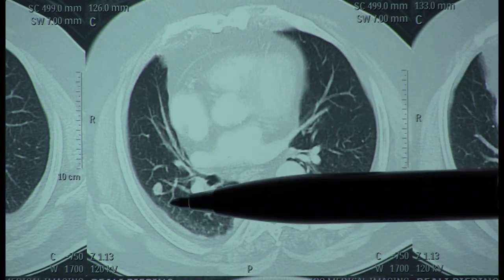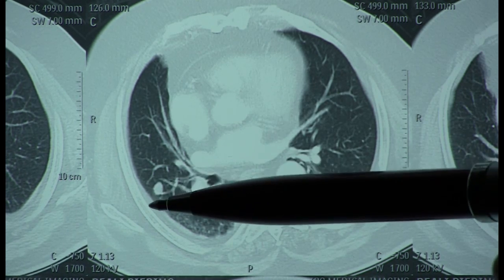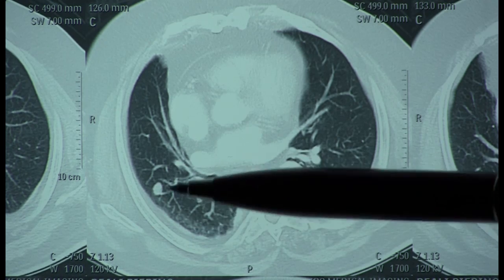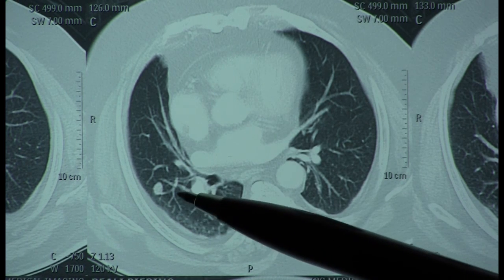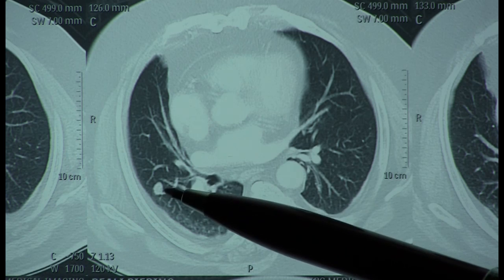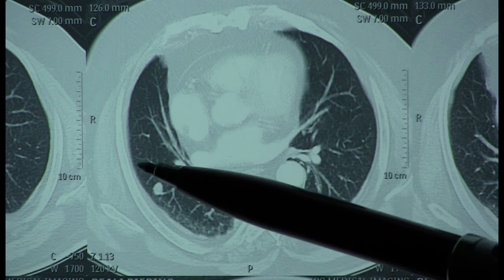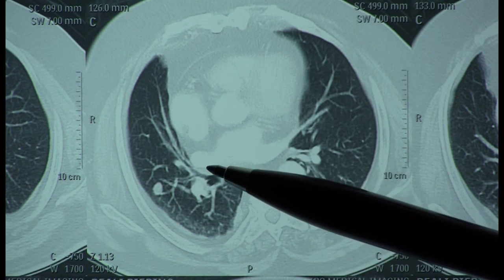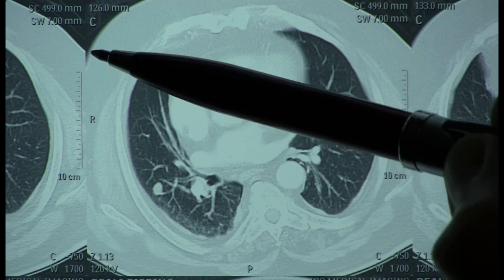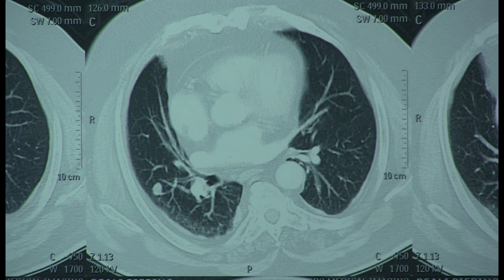We'll be angling up from below to get into this lesion because we've got to get in below this rib. Later in the video I'll show you how the anaesthetist controls the breathing and produces a picture which presents this nodule in a position with respect to the ribs that I can access it. And I'll show you how we're going to angle in to reach this nodule with the radiofrequency ablation probe.